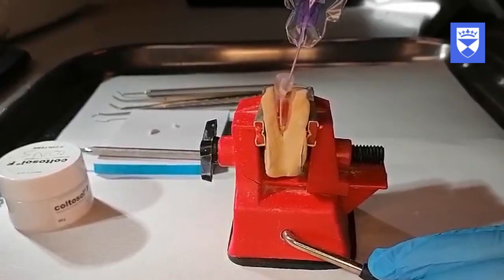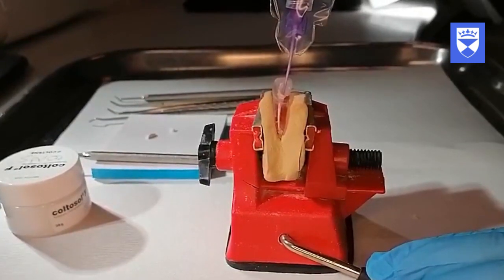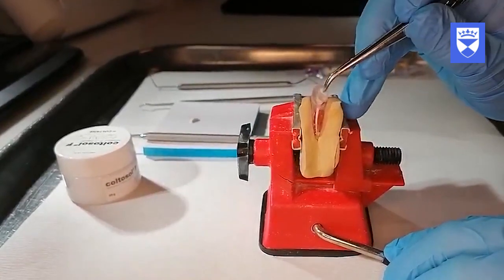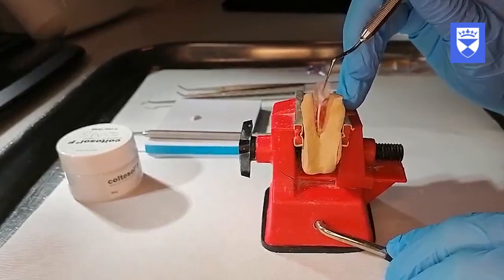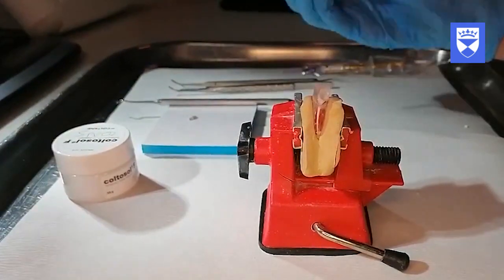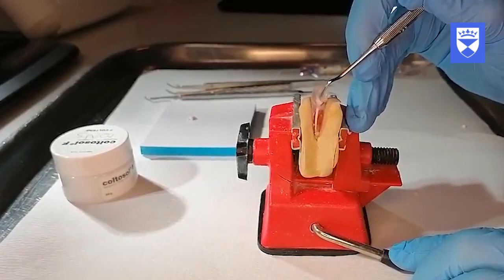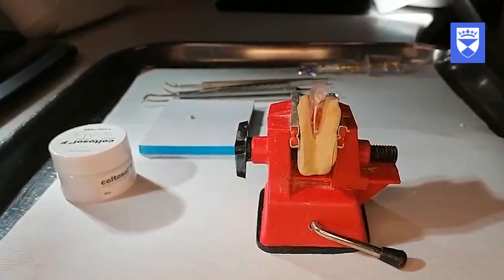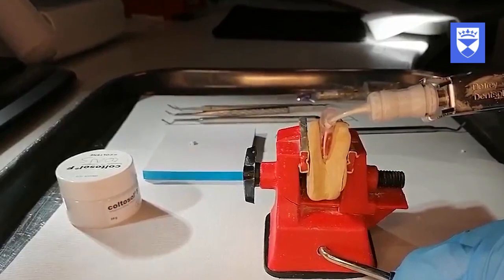The root canal should then be filled with non-setting calcium hydroxide paste. A sterile cotton wool pledget should be placed in the canal orifice and packed in gently using a DG16 probe. Place a ball of zinc oxide eugenol cement into the access cavity and pack.